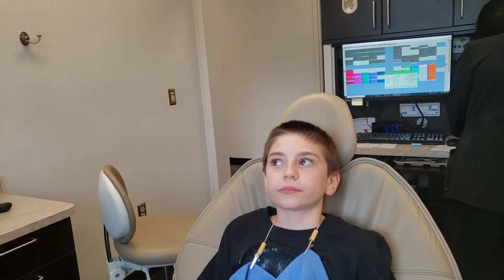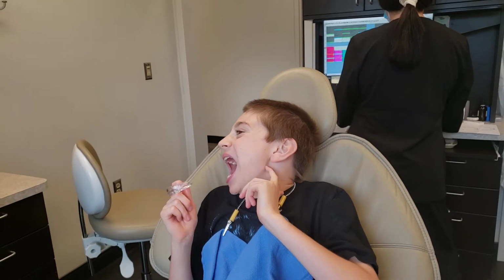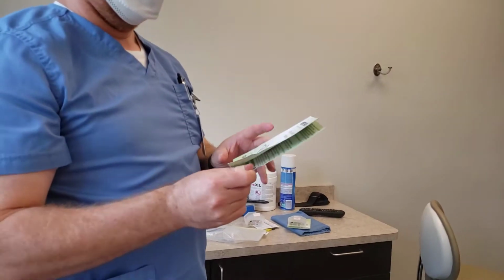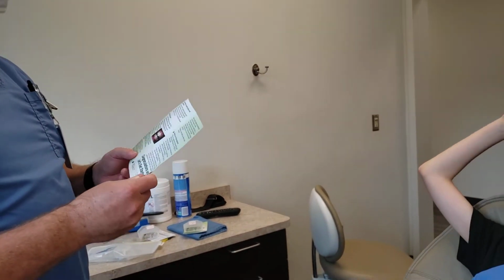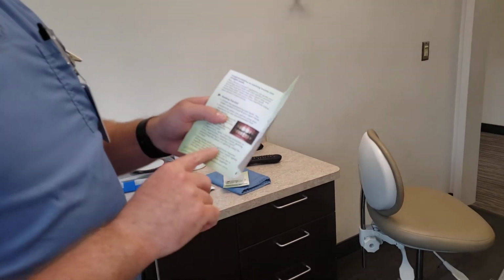By wearing it, he doesn't need to, I don't want him doing any exercising with it right now. Here's a chart for the guide also. And then the teeth trainer at night. So this talks about exercising.